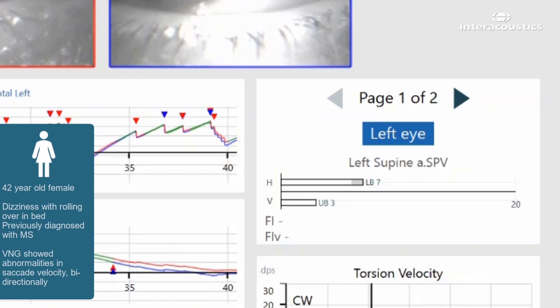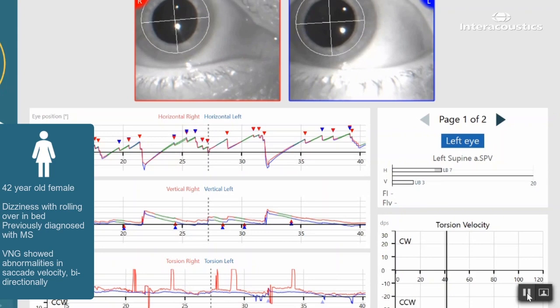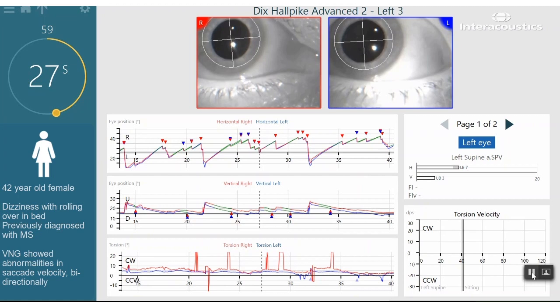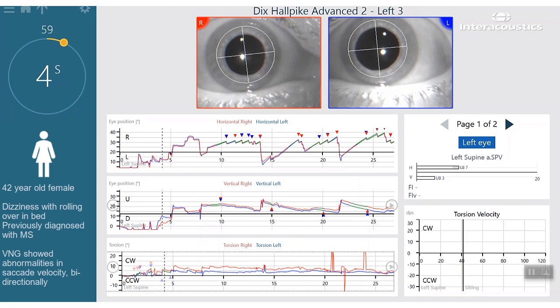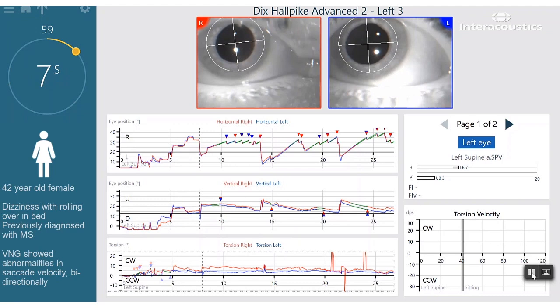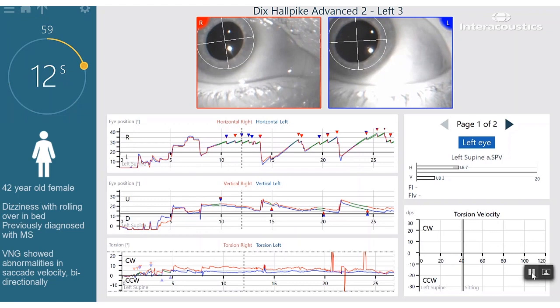Upon inspection of those graphs only, you may be inclined to believe this patient had a mild left posterior canal BPPV. Yet if we play the video and look at the torsion trace and torsion velocity graph, you can see that there are no identified beats of torsional nystagmus. The lack of torsion in this case helps the examiner avoid a misdiagnosis. This patient was actually diagnosed with central positional vertigo, as evidenced by horizontal and vertical eye traces along with no visible torsional nystagmus, highlighting the benefit of recording all three components of eye movement.